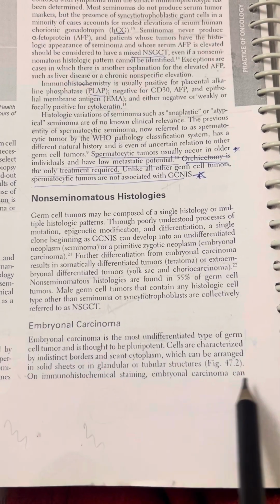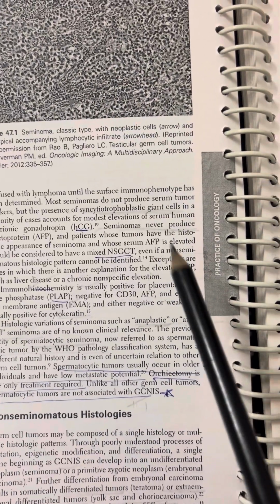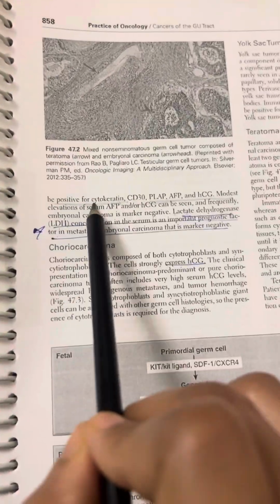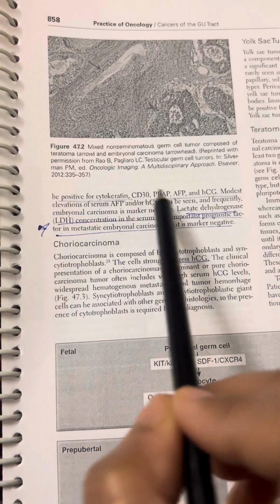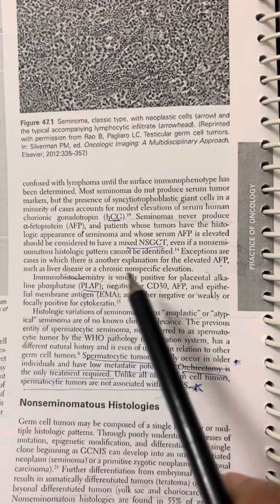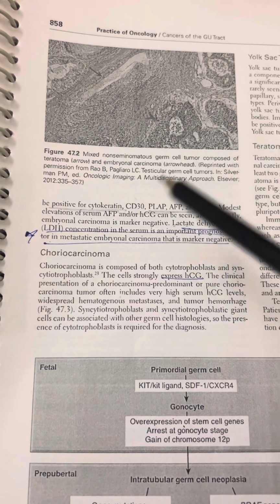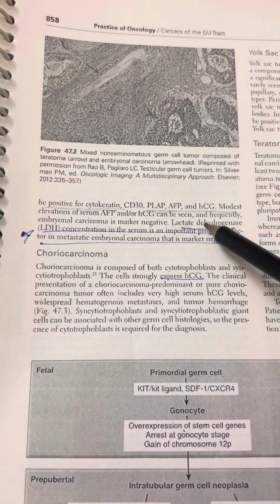On IHC staining, embryonal carcinoma is positive for cytokeratin. We saw that in seminoma it is faintly positive for cytokeratin. Seminoma was only positive for PLAP and negative for CD30, AFP and EMA, but embryonal carcinoma is positive for cytokeratin as well as CD30, PLAP, AFP and HCG.